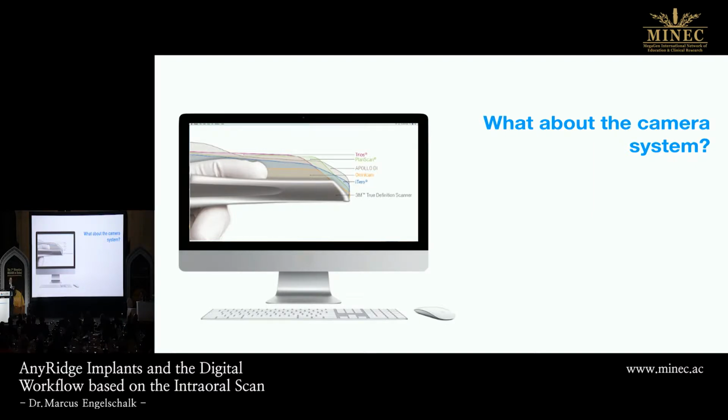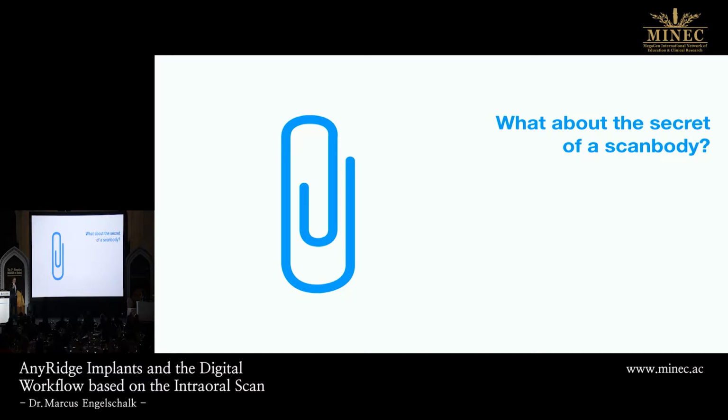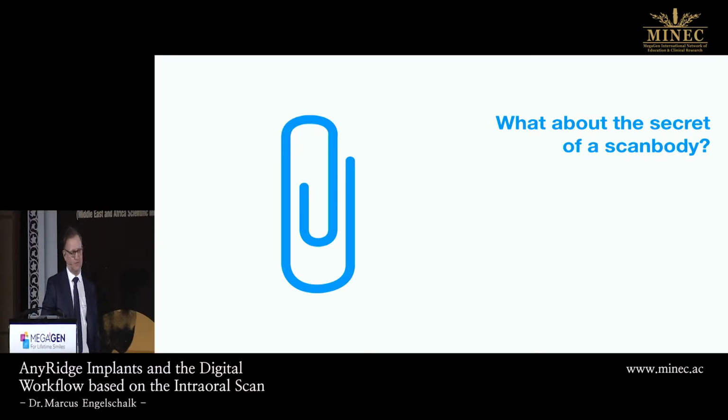There are different sizes, and the size is always driven by the technique inside the wand or the evolution of the scanner, and you will see it if you use it in the patient's mouth, because outside of the mouth, every size is easy to use on a model. It's important to think about. But the really important thing is that we have to transfer the information of an implant to the CAD/CAM system, to the software, and there we are guided by a scan body. And there are some secrets about the scan body.